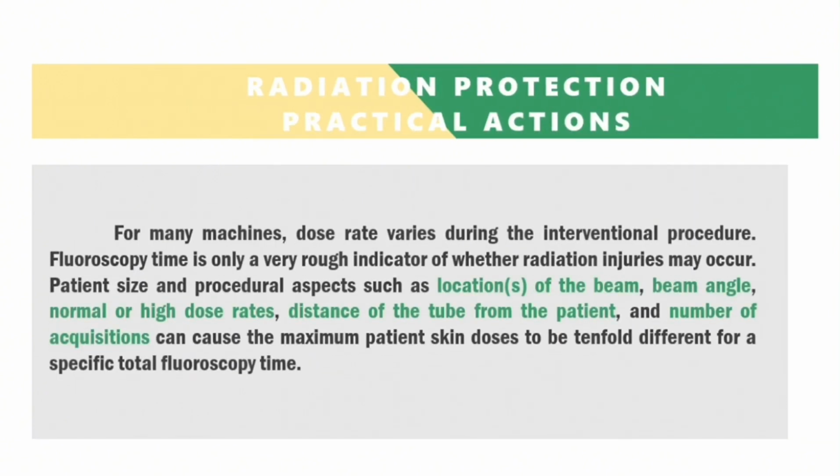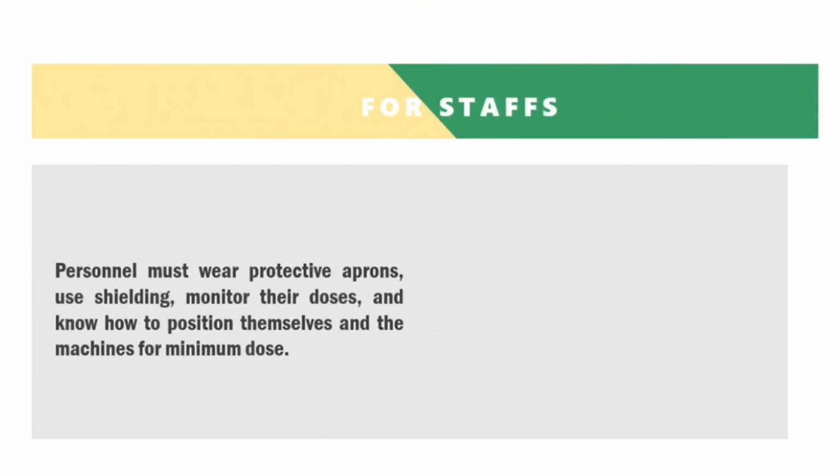In variable dose rates during intervention, dose rates can vary during an interventional procedure. It's crucial to monitor factors like beam location, angle, and dose rates to assess potential radiation injuries accurately. Now, let's shift our focus to controlling dose to our dedicated staff.